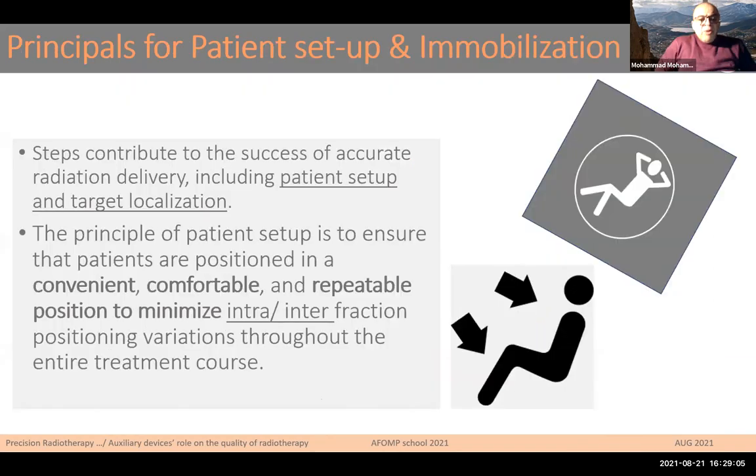The principle of patient setup is to ensure that the patient is positioned in a convenient, comfortable situation and in a repeatable position to minimize the intra- and interfraction positioning errors. It's important, even now, that interfraction position verification or variation is challenging. Monitoring is a challenging issue and is not really easy to cover.